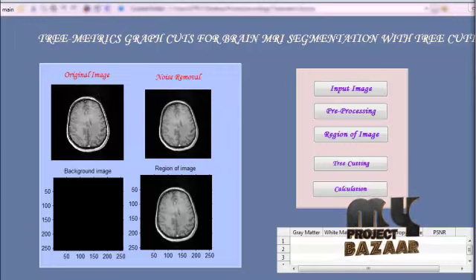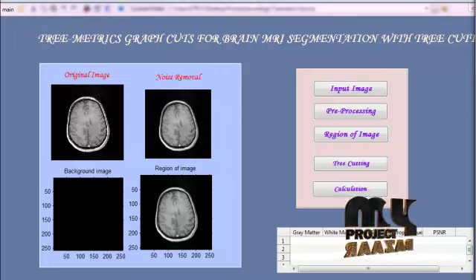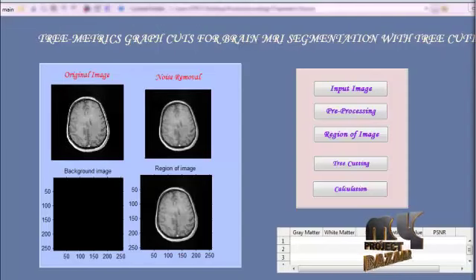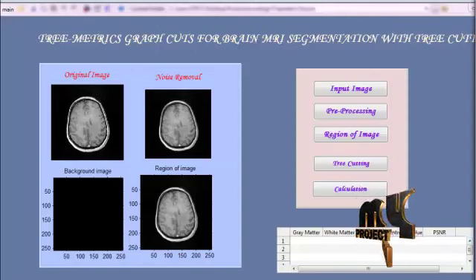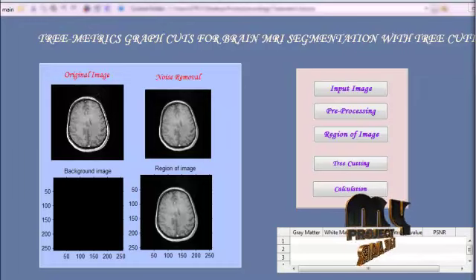The labeling returned by the tree metric algorithm does not directly correspond to the tissue classes in the brain. Therefore, we need to map the grayscale labels to 4 labels: gray matter, white matter, CSF, and also the background. We create this mapping with the tree cutting method. To reduce 256 labels to 4 labels, we cut our binary tree of labels at depth log base 2 of 4, equal to 2. For each node at depth 2, their child subtree is now mapped to the same label.